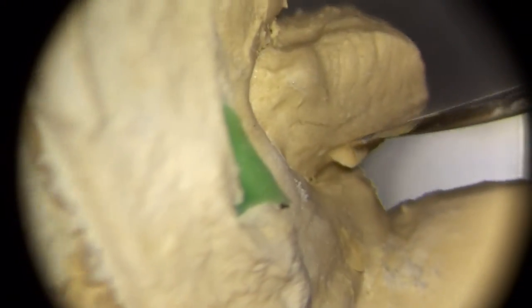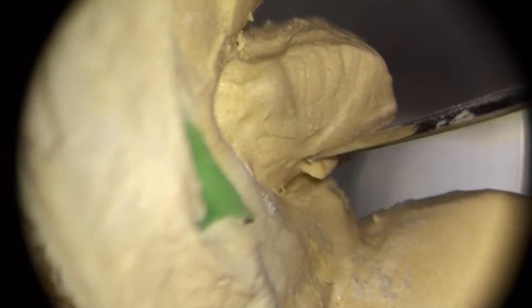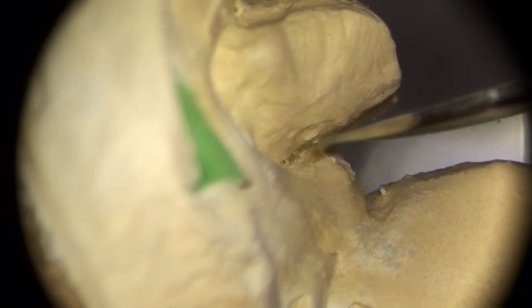So that adjacent tooth is hung over too far, it makes it really tough to clean up the embrasures. So it's probably done on purpose. It's usually not done accidentally. Somehow the doctors are able to do that without hitting the adjacent teeth most of the time. So tricky spot, here's a big old bubble. It'll just pop right off most of the time. It's kind of weird how that works.